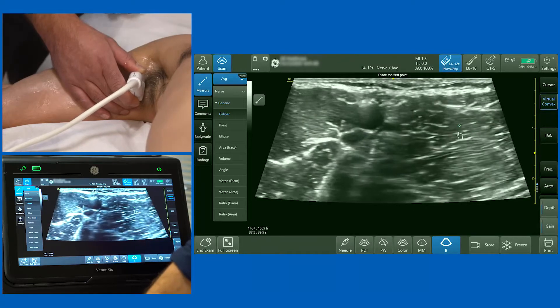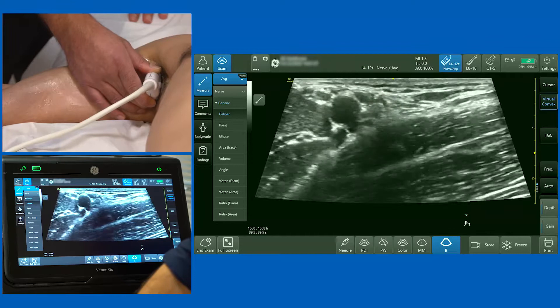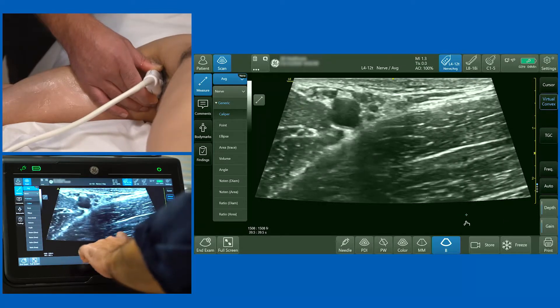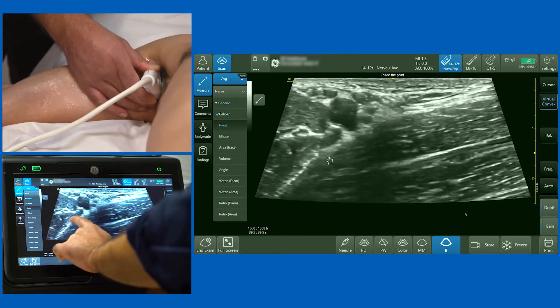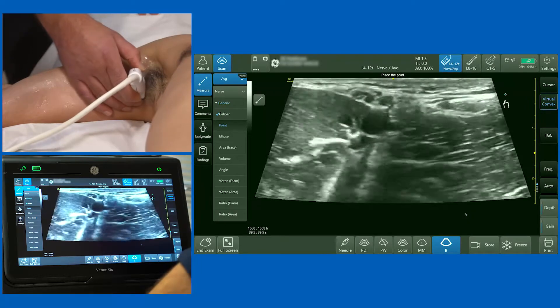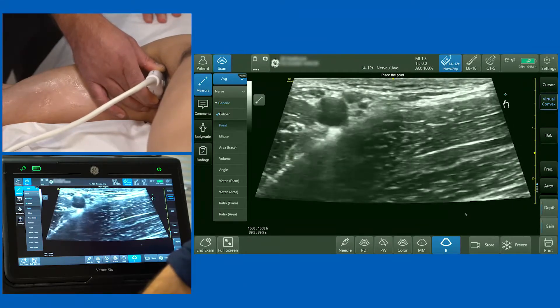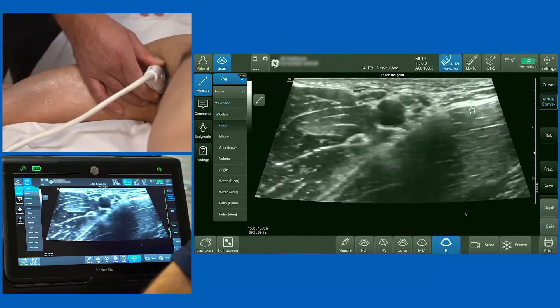The key is to slide the probe more medial towards the chest wall. As you do, look at what appears on the right-hand side of the screen: a beautiful structure — the conjoint tendon, formed from latissimus dorsi and teres major. You know you're in the right place when you see this very obvious thick bright white line. If you see this image, you are not proximal enough; slide the probe back towards the midline.